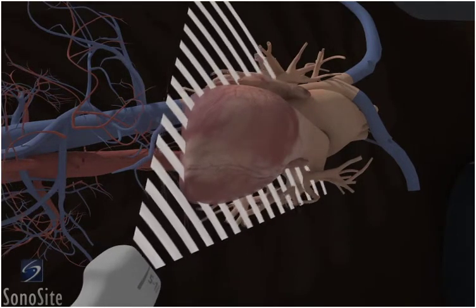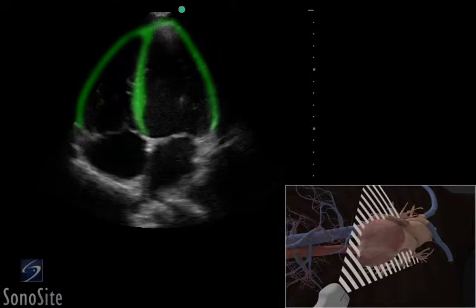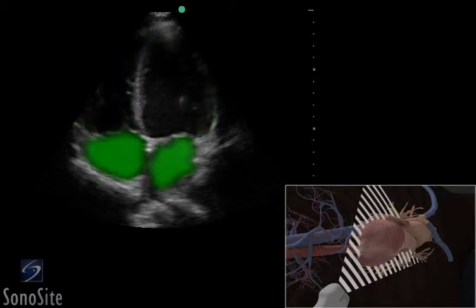Aim to the right shoulder. The apex of the heart is visualized closest to the transducer. The myocardium will appear gray and the blood-filled chambers will appear hypoechoic. The ventricles are in the near field and the atria are in the far field of the image.